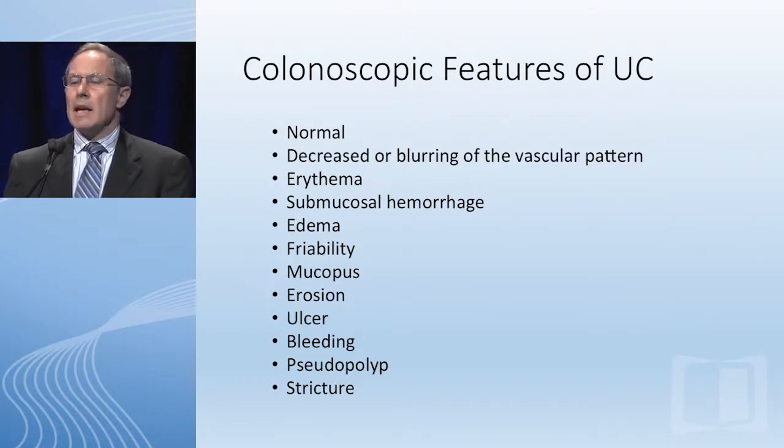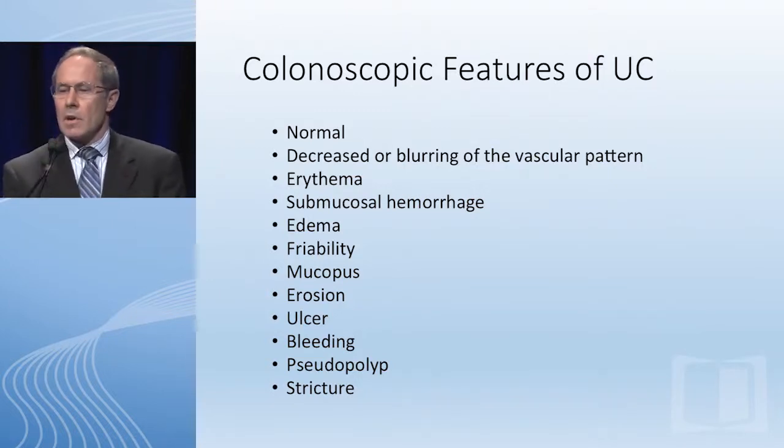These include the Mayo score and the UCEIS, which Gary described earlier, and these can be applied to clinical practice. They may not be widely done so, but in the future, I think the potential certainly makes good sense.